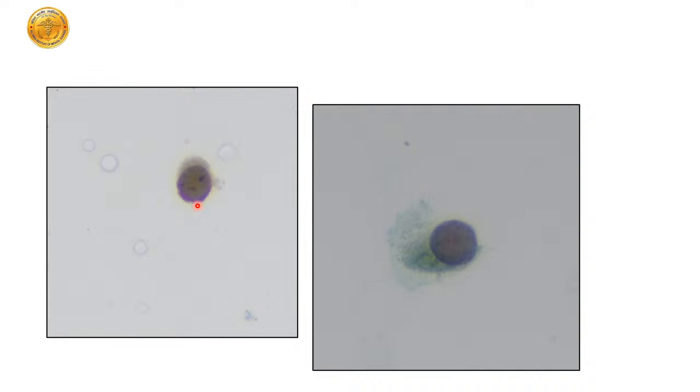So this is for the time. You can type out your answer, I'm okay with that. So we have a cell with a high NC ratio. Yes, absolutely, Nusrat, absolutely right. It is a decoy cell, Preeti.